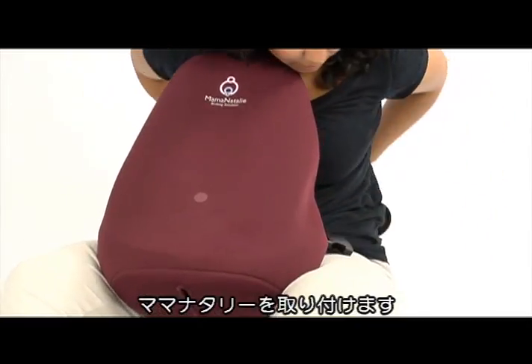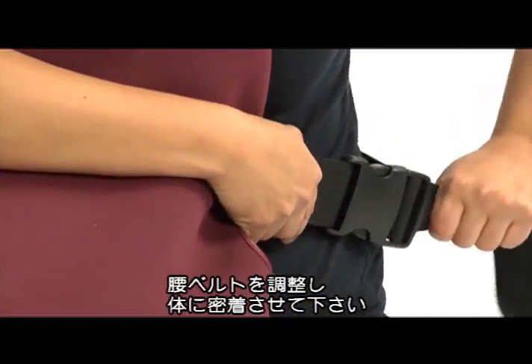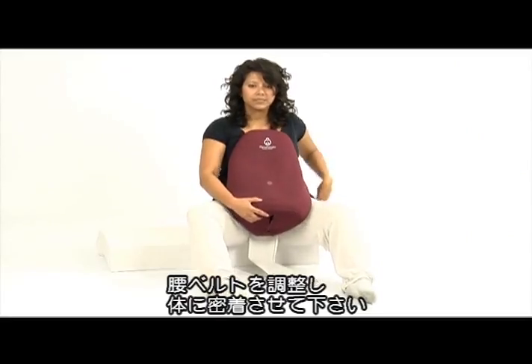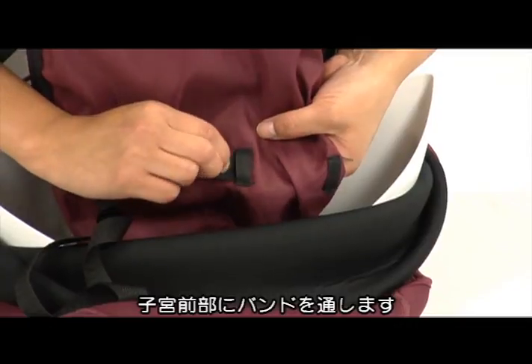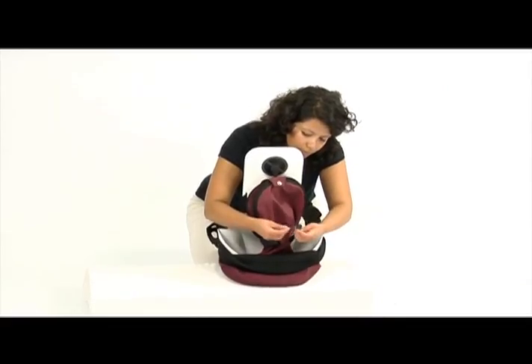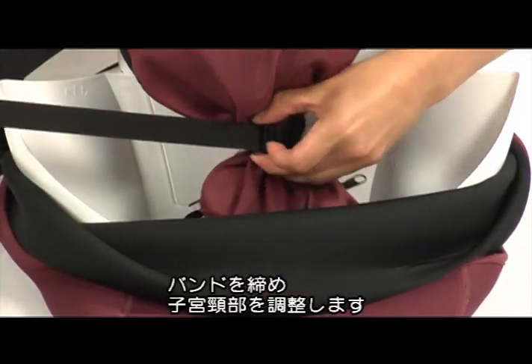Strap Mama Natalie around your waist. Adjust the belt so that the simulator is secure and snug against your body. Pass the cervix ribbon through the holders in front of the uterus. Tighten the cervix band to the desired level.